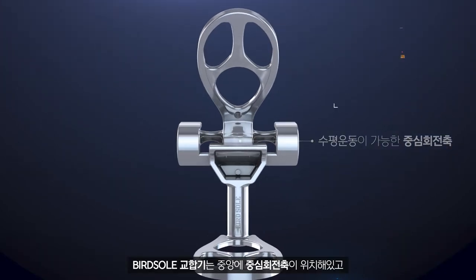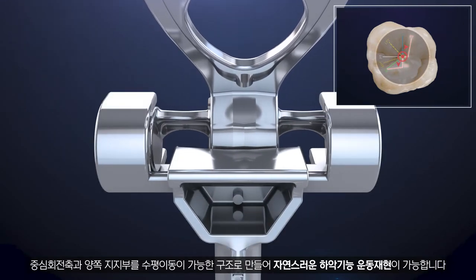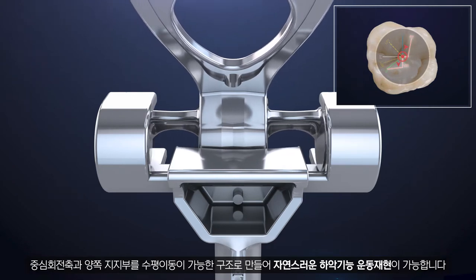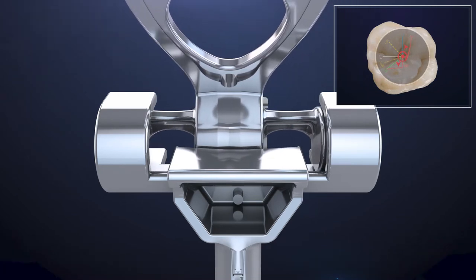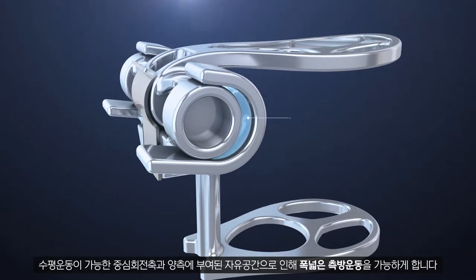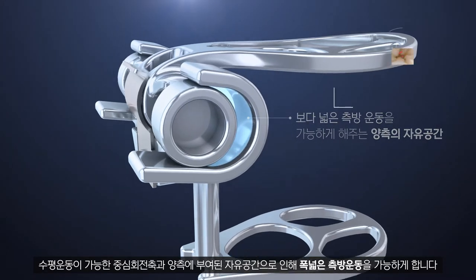BirdSole articulator enables natural mandibular movement with its central rotation axis at the center. The central rotation axis and supporting part with a structure for horizontal movement, along with free space on both sides, enable a wide lateral movement.